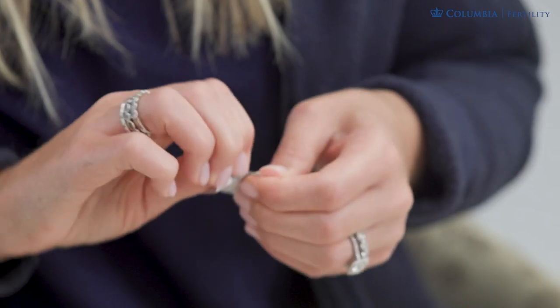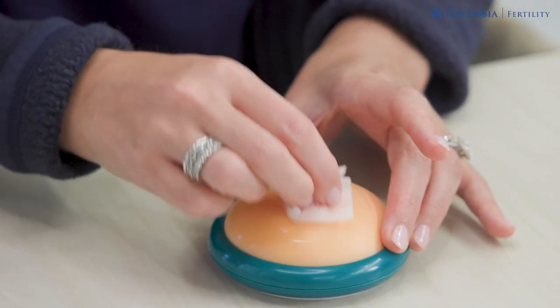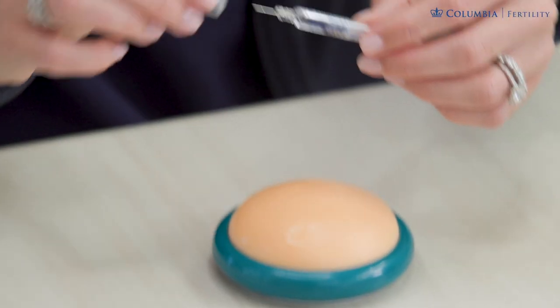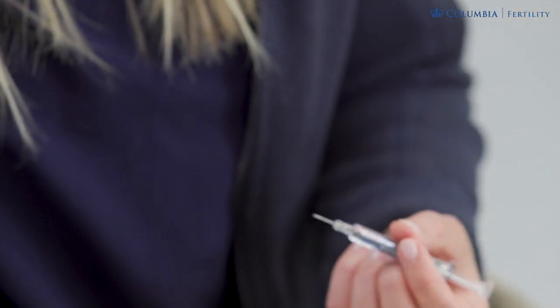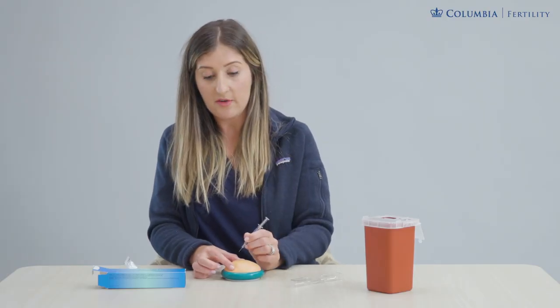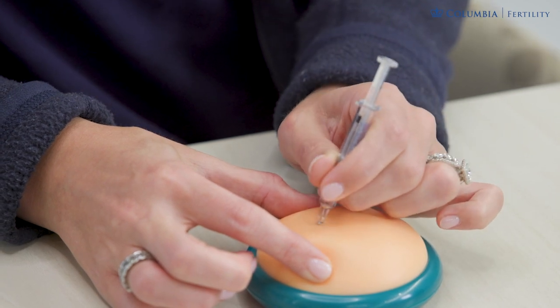An alcohol swab will clean the skin to prepare the area, and this is the same type of injection that you've likely been doing prior. On that area of clean skin, uncap the needle, pinch the skin, and hold the syringe like a pen or a dart at a 45 to 90 degree angle — one, two, three — the whole needle tip goes in.